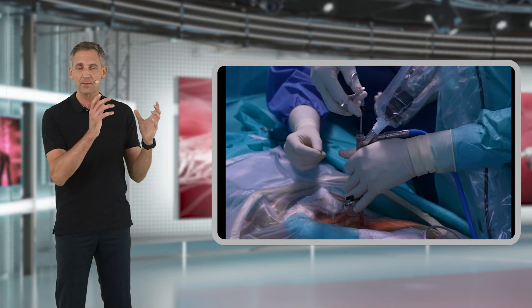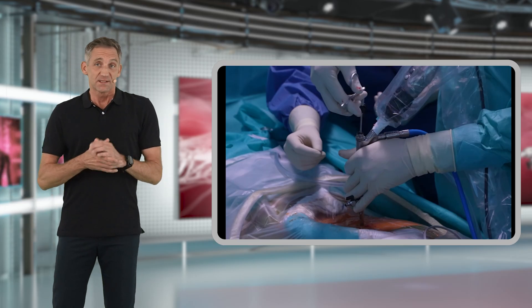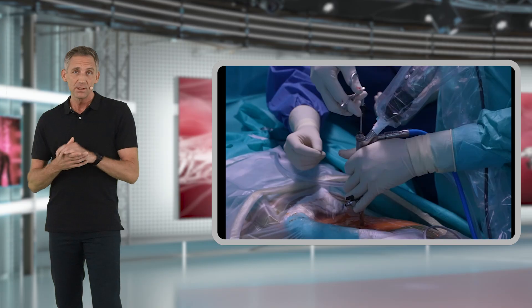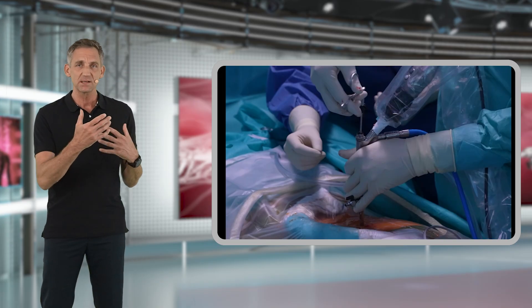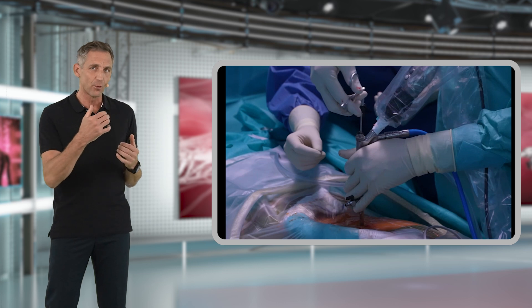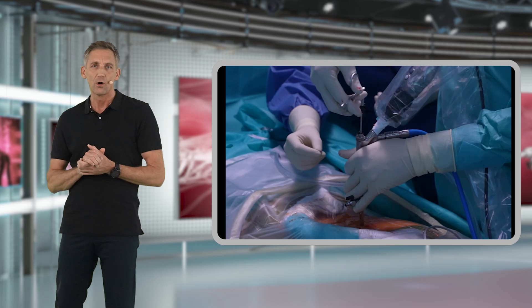In the majority of cases you will be able to remove disc fragments as shown. However, some massive disc herniations may be so large that they don't pass through the four or even five millimeter working channel of your endoscope.